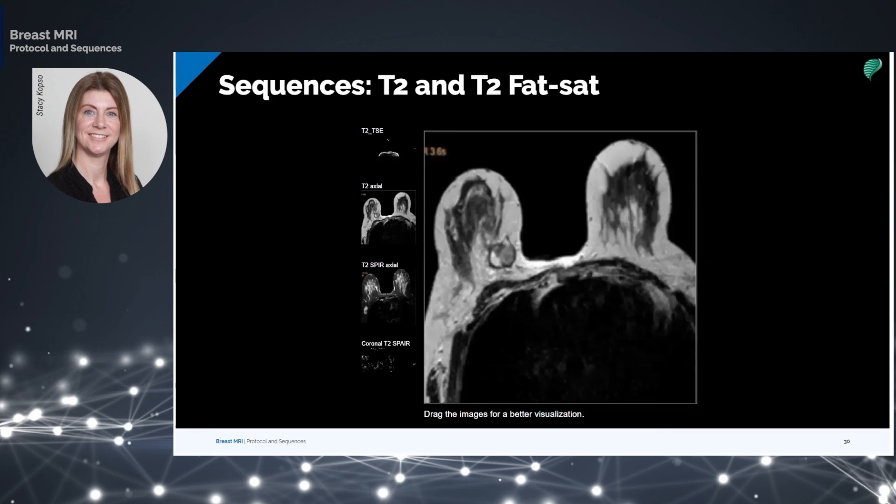Lesions that appear hyperintense on T2 and T2 fat sat are cysts, fibroadenomas, malignant lesions, glandular tissue, and inflammation of the mammary ducts.